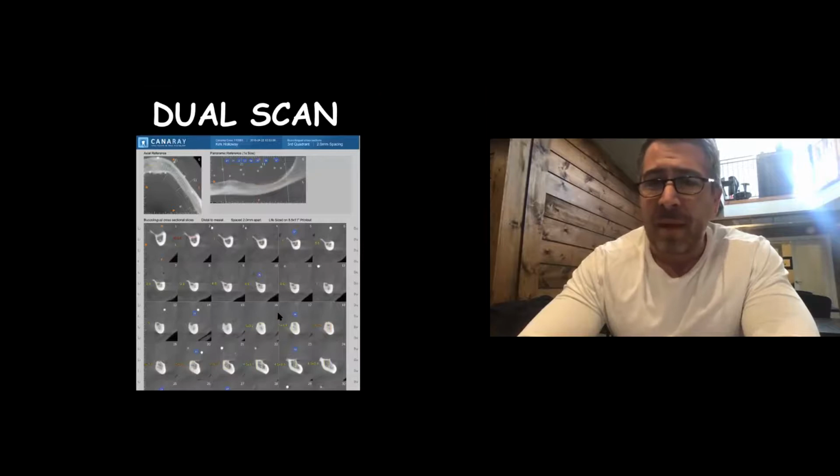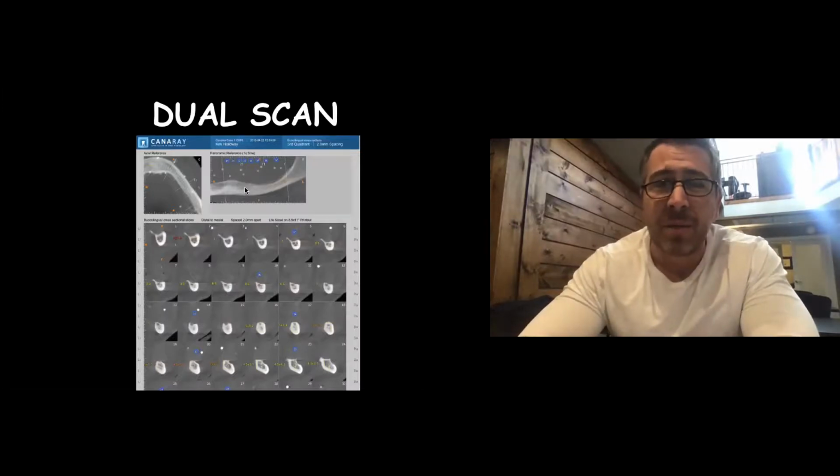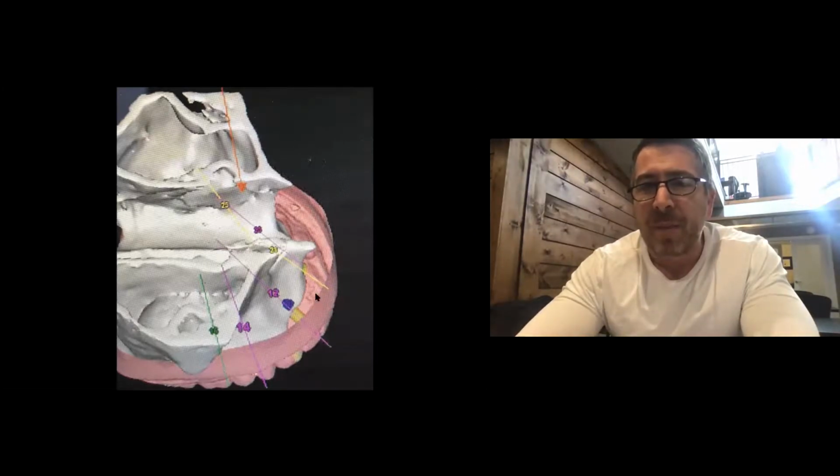So proper treatment planning means not just looking at a bone and firing 4 implants into it that work for the bone. It means putting 4 implants in the bone that work for the bone and work for the prosthetic that you're trying to accomplish. Again, going back to that case that the doctor sent me, you can see here where her patient's prosthetic belongs and where the patient wants, look how facial that is to where that buccal anterior maxilla is. It's too far facial.